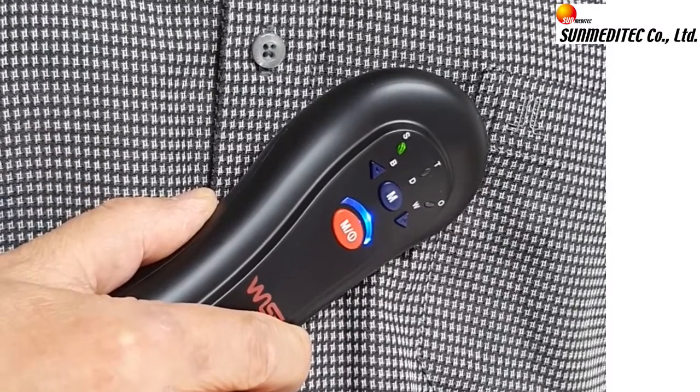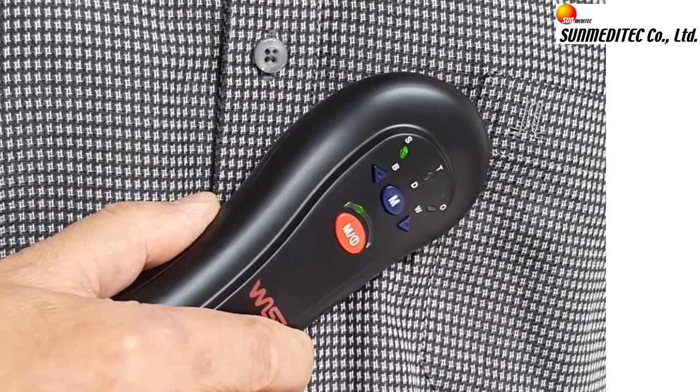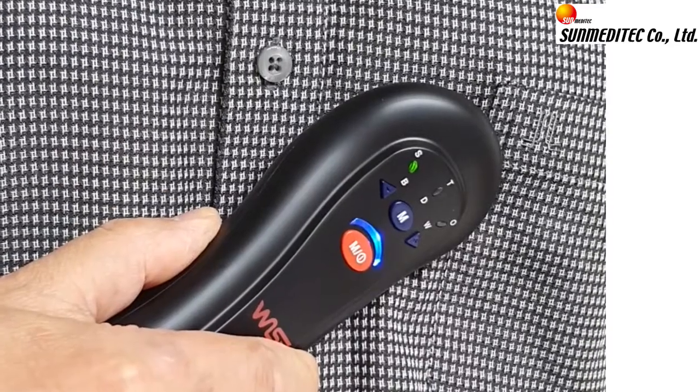Let's check, and I can hear my heart sound. Plug in your earphone and listen to my heart sound.